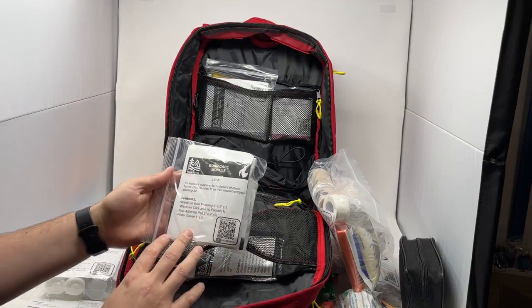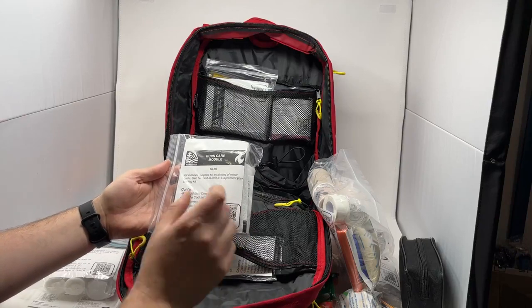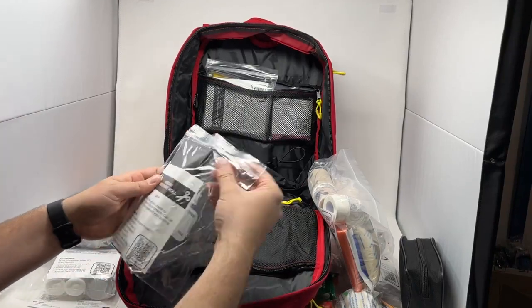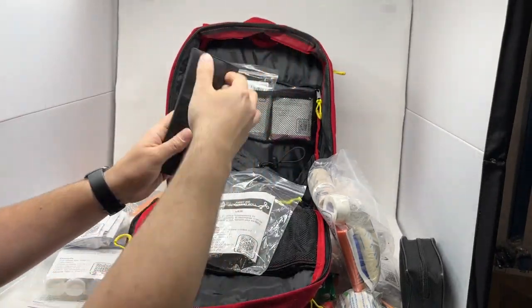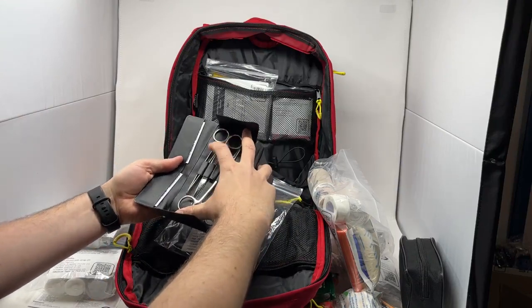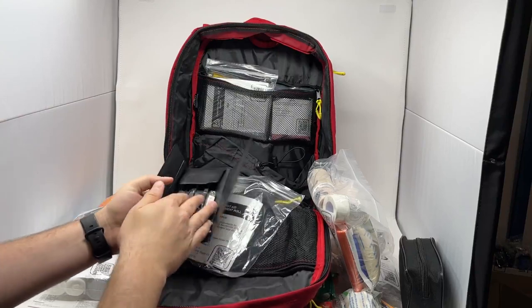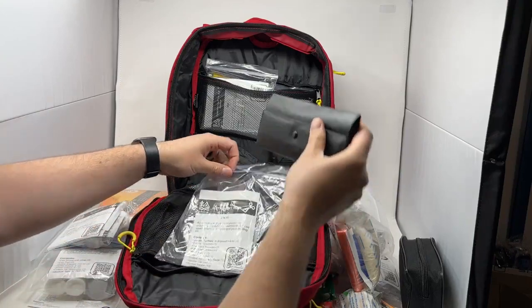Our burn module also has a QR code and a guide on the back. It has a water gel dressing, a water gel packet, two non-adherent pads, and a roller gauze — great for treating minor burns. Then we have our first aid instrument roll, nicely packed to keep it water resistant. It comes in a really nice organizing case with all your first aid instruments: Kelly clamp, scissors, tweezers, nail clippers, splinter removal tools, a scalpel, a magnifying glass to clean out wounds, and alcohol prep pads to clean your instruments before and after.